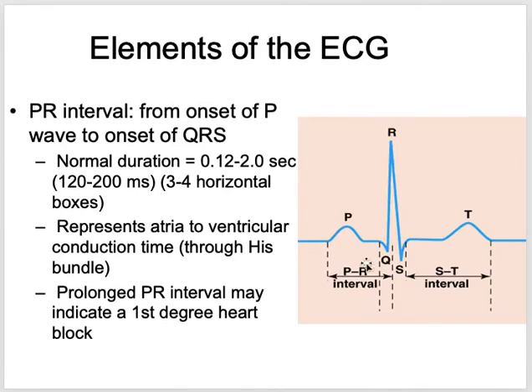After that, there is the QRS complex. After that, by the way, there is the PR interval, but we are not discussing intervals first, rather we are discussing the QRS complex first. Remember, there are intervals, there are segments, and there are waves. So P wave, and then there is the QRS wave. This downward dip is called the Q wave, just this much. This upward going is the R wave, and then this small dip is the S wave. Collectively they are called the QRS complex, and they represent ventricular depolarization. And then in the end, there is one more upward deflection, which is the T wave. This represents ventricular repolarization. And then the cycle will repeat itself.